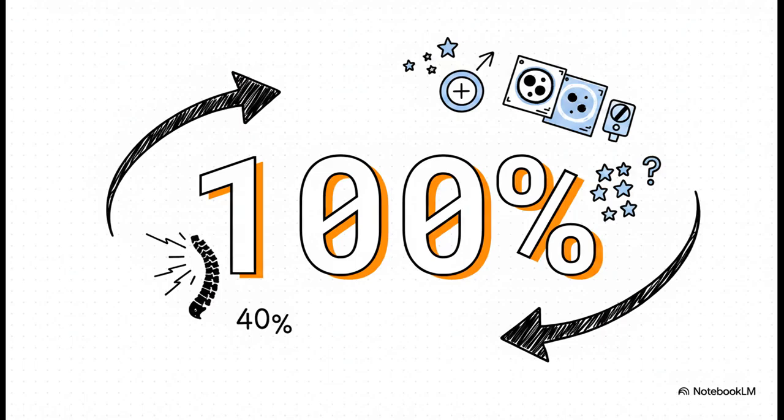Let that sink in for a second. A quiet PET scan within 90 days of radiation correlated with 100% local control at 2 years, compared to just 40% for the non-MCR group. This makes early nuclear imaging an incredibly powerful surrogate marker for treatment success.